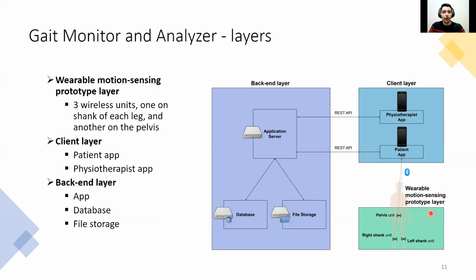And how this layer works is each unit will read data from its sensor and then transmit it through Bluetooth to a patient app, which is a mobile Android application.